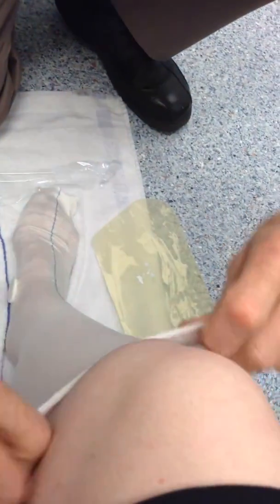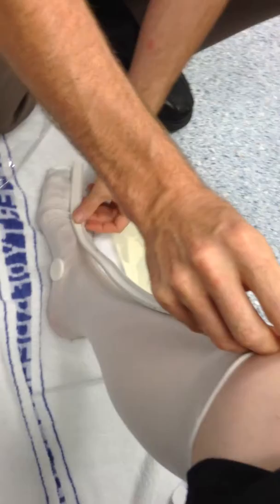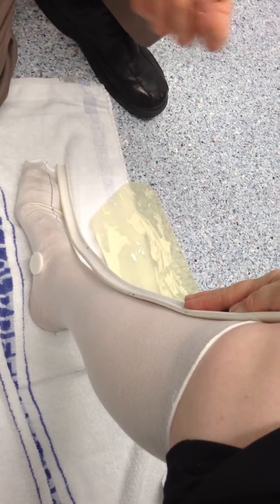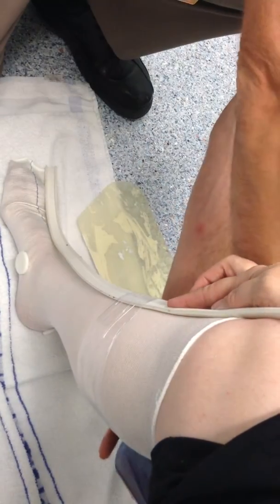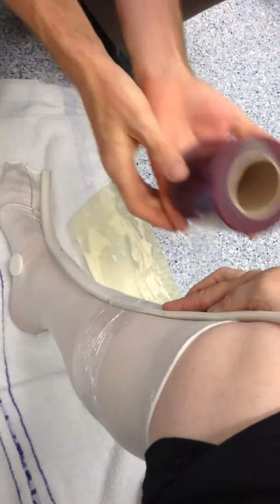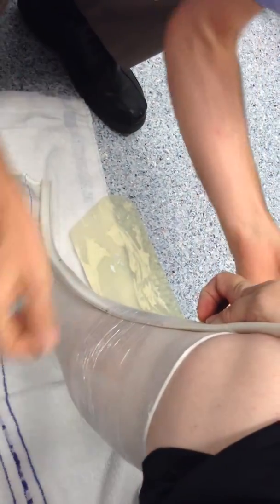Just put that up there a second. And then you have to multitask here and just hold that. And then what we'll do is just start wrapping that around once we've kind of got a couple of wraps on there. I don't remember the glad wrap last time — it's a new one. I think we used to just hold it. I can't remember now.